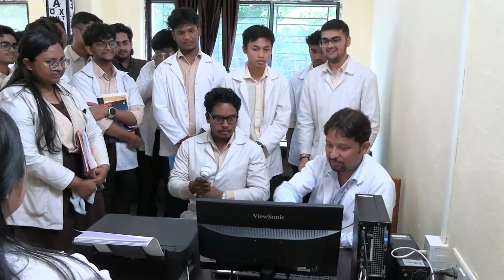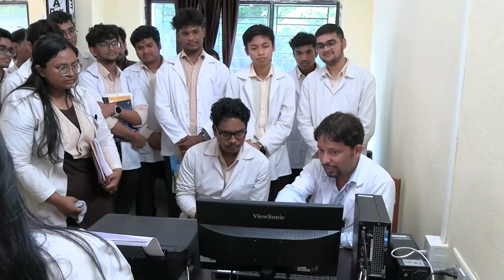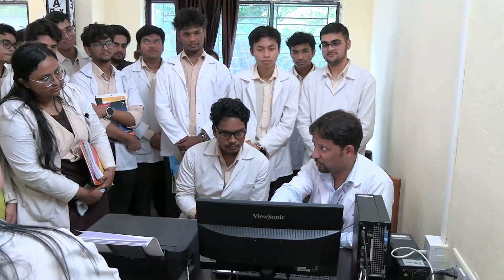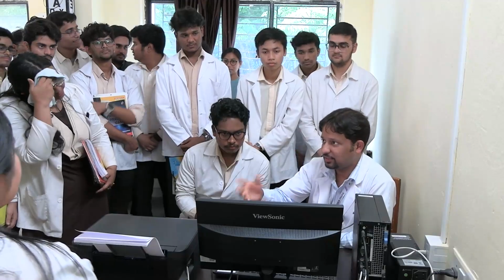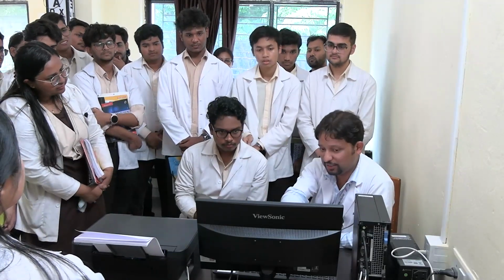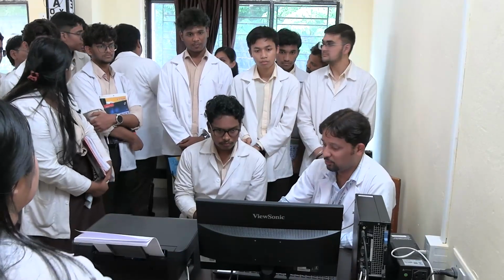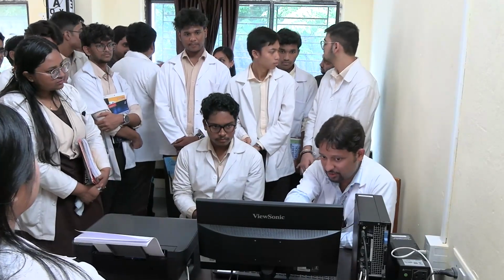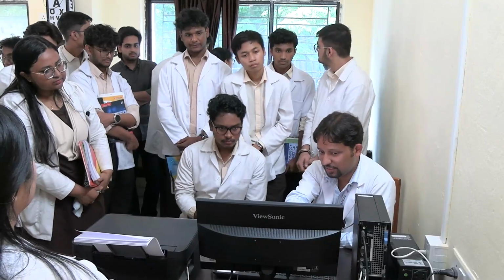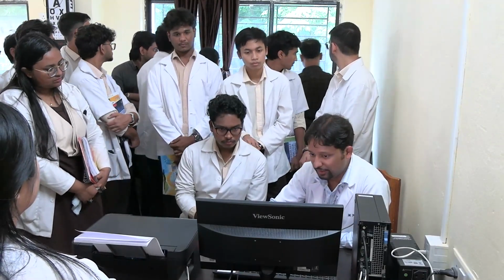So as you can see, this one is better, right? Visibly better. This is the ideal morphology of the loop. And software gives its own interpretation also. But again, as the subject expert, I have the discernment to decide which one is correct. If I feel this is acceptable, I'll go with this one. If I feel that was the right one, I'll go with the other one also. So this is a software interpretation. This also looks visibly better than the last one, the second maneuver, right? So new maneuver is better than the old, so we'll accept the new maneuver.